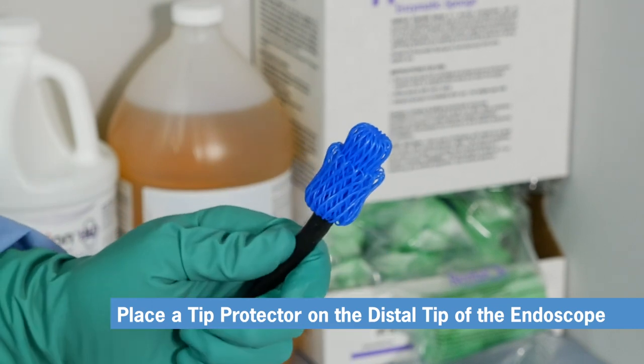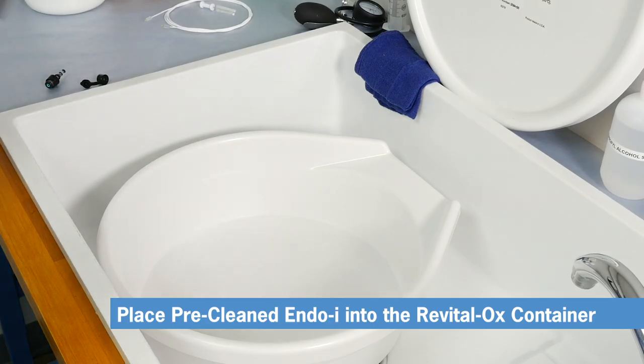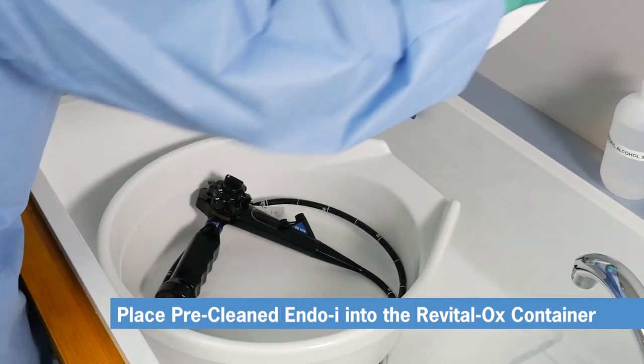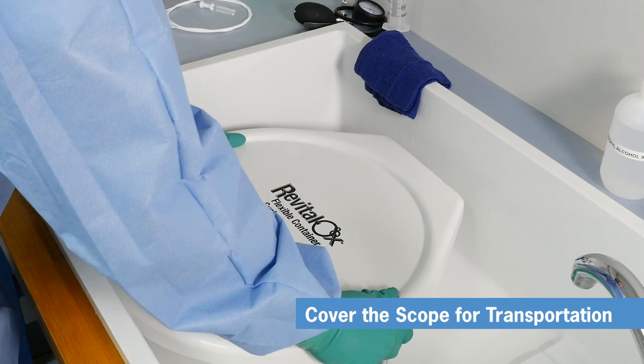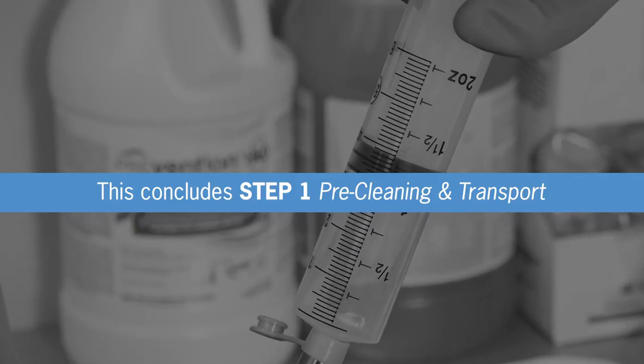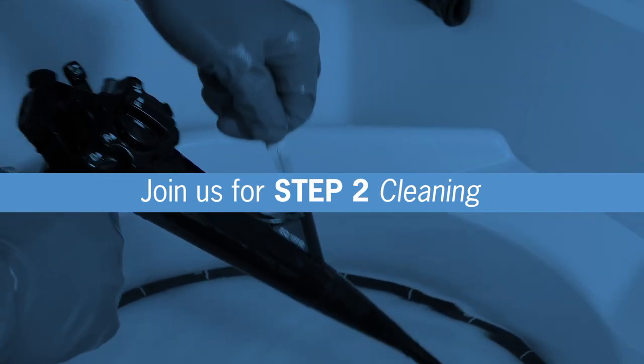Finally, place a tip protector on the distal tip of your scope and place the pre-cleaned Endo-i into the Revitalox container. Be careful not to coil your scope too tightly, then cover the scope for transportation. This completes Step 1, pre-cleaning of your Endo-i. In Step 2, we review the proper cleaning of your endoscope.